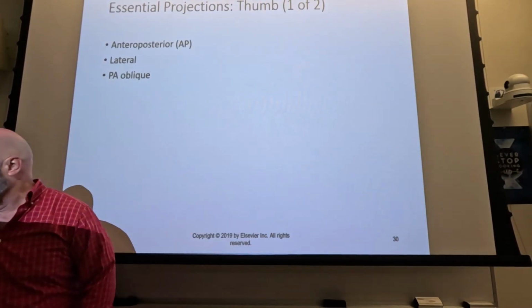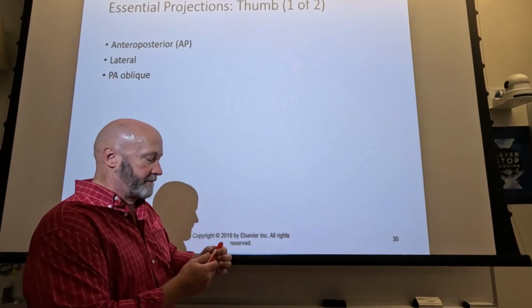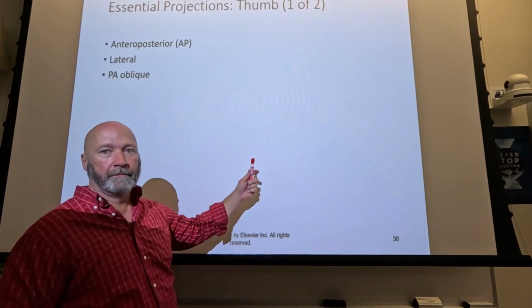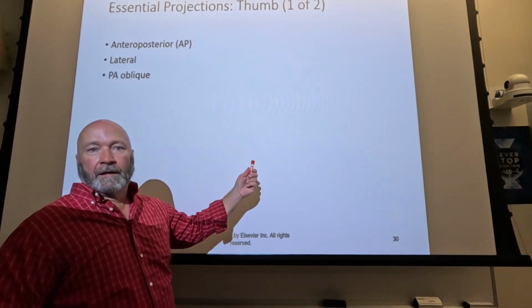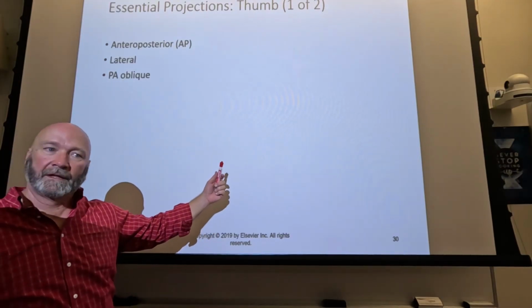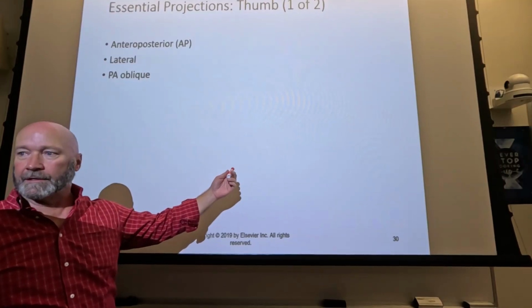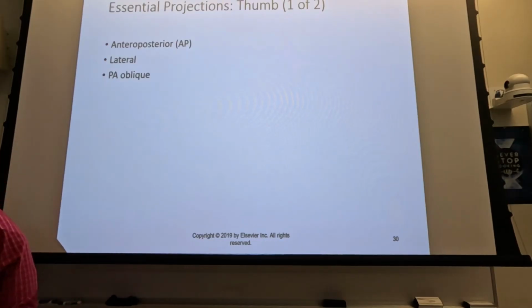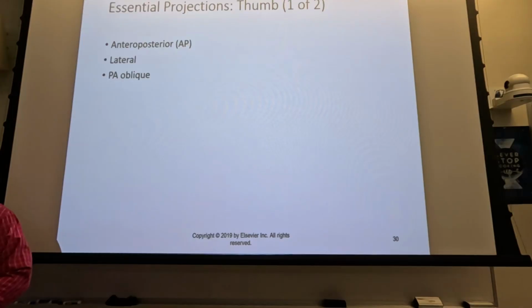And again, back to the marker, let's say this doesn't represent a fracture, but it represents our joint space. Okay, you can see the joint space, right? How about now? Not as much. Right. So you want to keep the anatomy parallel to the image receptor and the central ray perpendicular to the image receptor so that you don't close the joint space up. So just prioritize that. Keep it as parallel as possible, but keep your OID as low as possible.